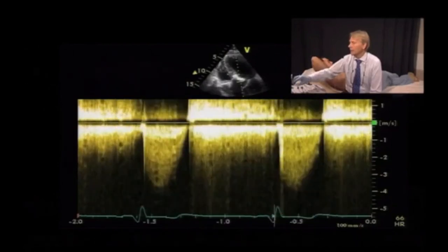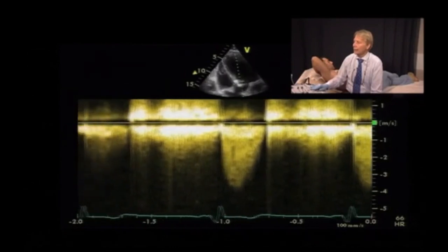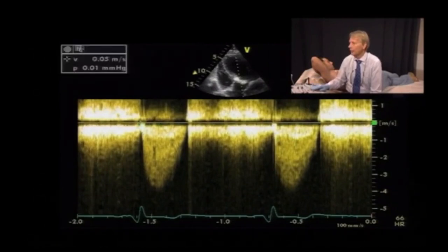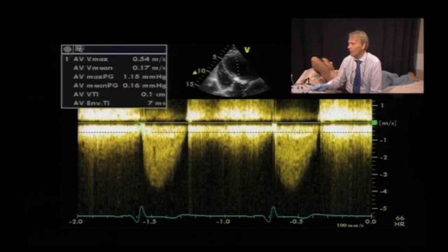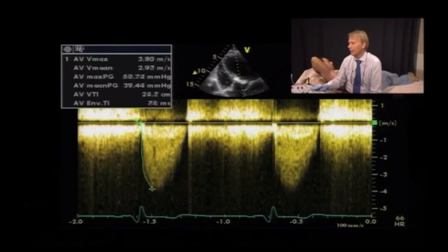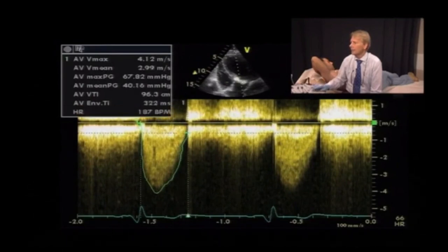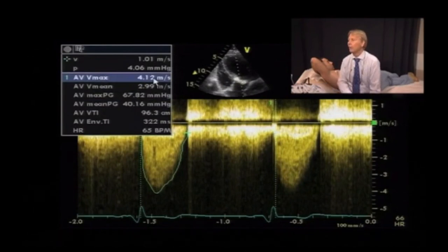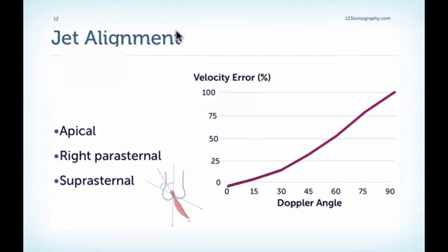Once you have the optimal signal and you believe you have the maximum velocity, freeze the curve and optimize the time axis for higher accuracy when quantifying gradients. Look for the beat where you have the maximum velocity, then perform a trace around the curve beginning with aortic valve opening, tracing the contours carefully and avoiding artifact portions, all the way to aortic valve closure. This gives us a mean gradient of 40 mmHg and a maximum velocity of 4.1 meters per second.